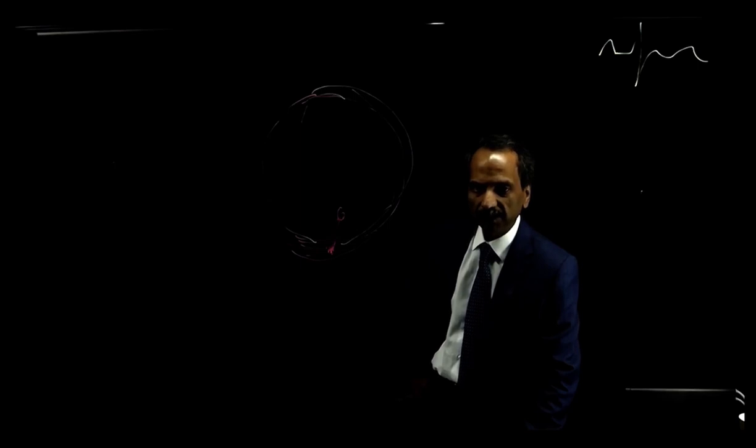Okay, so maybe I'll draw a picture here for that as well. And if any of you have a case you'd like to share that illustrates that, that'll be fine too. So here's the problem. If this is where we've drawn the line, whatever this is, mitral isthmus, tricuspid isthmus, roof, and we want to know, does conduction go from here to here? The problem is, if there's very slow conduction, we're trying to see, does it come out there?